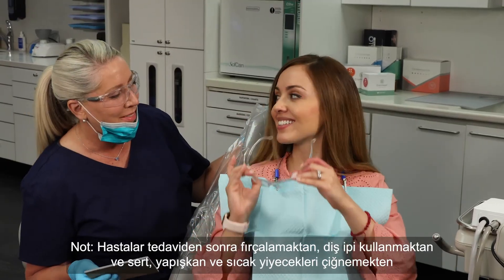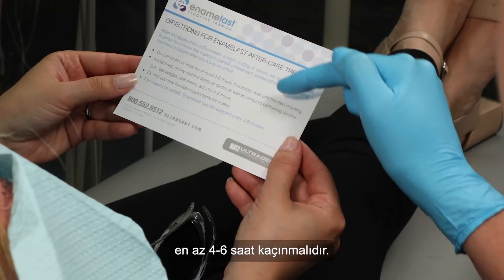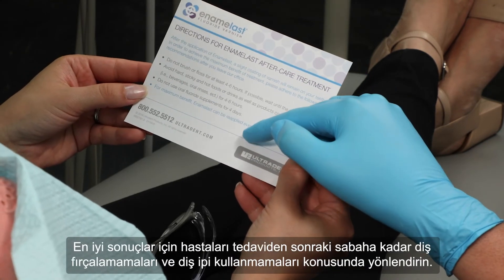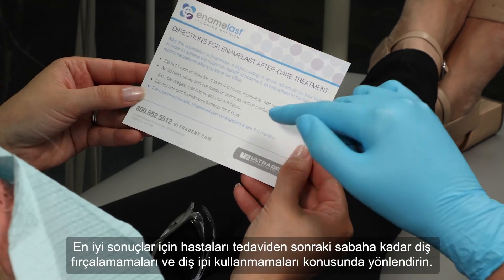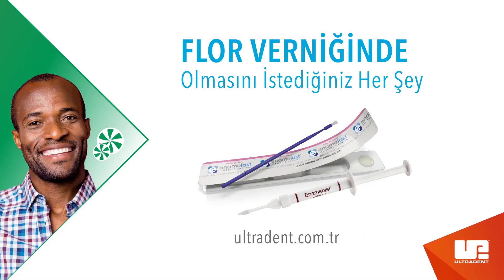Note: patients should avoid brushing, flossing, and chewing hard, sticky, and hot foods for at least four to six hours after treatment. For best results, encourage patients to skip brushing and flossing until the morning after treatment.